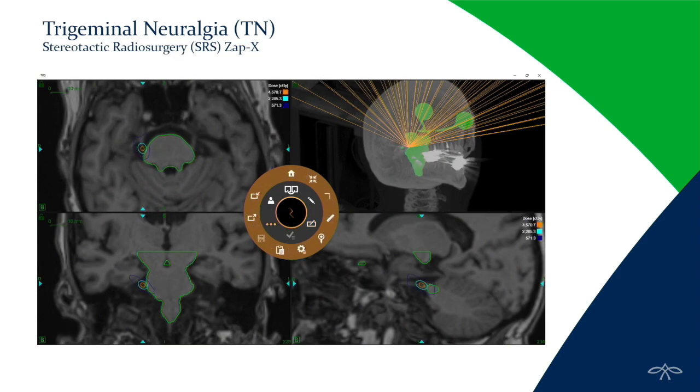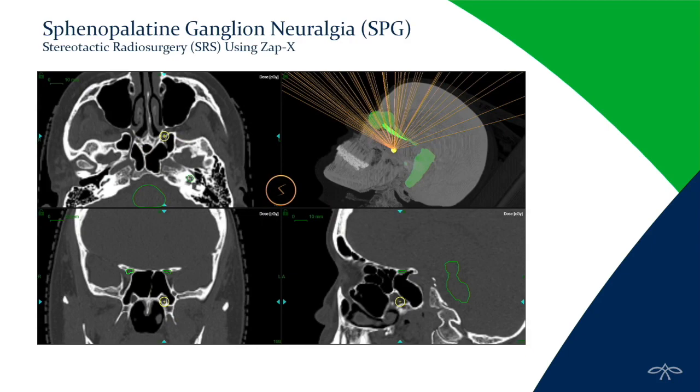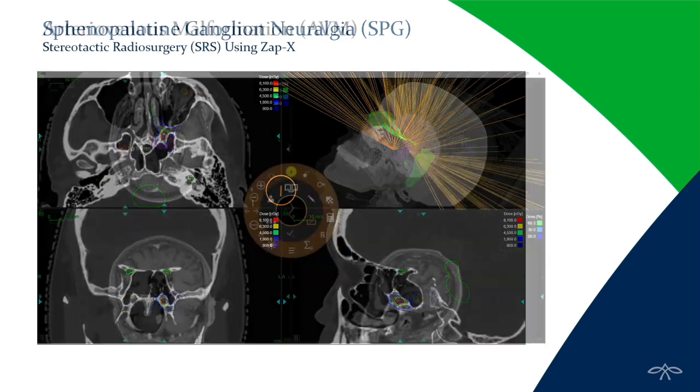Dose distribution looks pretty good, but if you look at the beam arrangements, which are the rays that you see up here in the corner, all of them are going through their face, less than ideal. But that is part of the design of the ZAP-X. They're addressing that by readjusting the design of the couch to a proton couch, which should give us more posterior beams. Same thing, SPG, mostly through the face. They say you have 2 pi solutions. You actually have about pi solutions, and half of that if you're really super lucky. Dose distribution looks really great, with a steep gradient, because you're dealing with basically Gamma Knife energies.